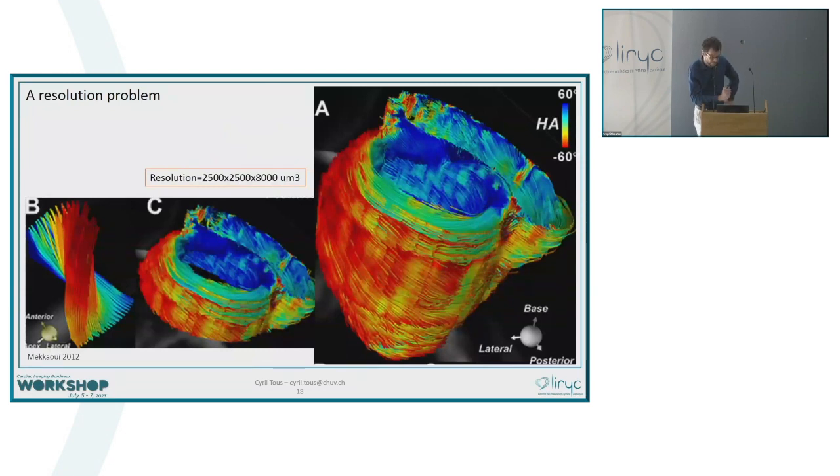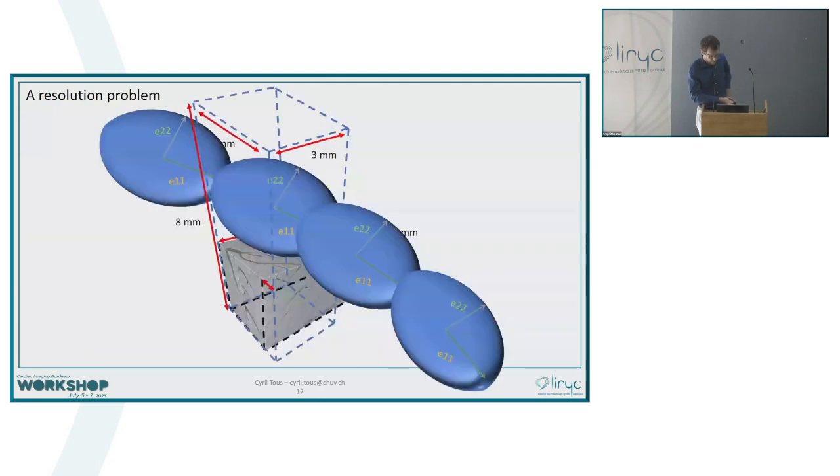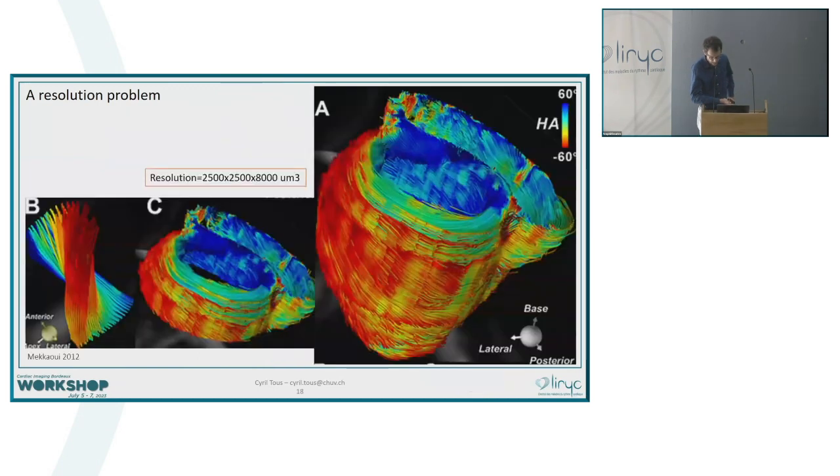It's really important to understand that this kind of tractography is useful from an academic point of view, where you can roughly understand how the fiber configuration works, but it doesn't have any clinical value because there's a lot of interpolation, and it doesn't really underline the complexity of the microstructure at the macro scales. But it at least gives you an overview of how it looks.